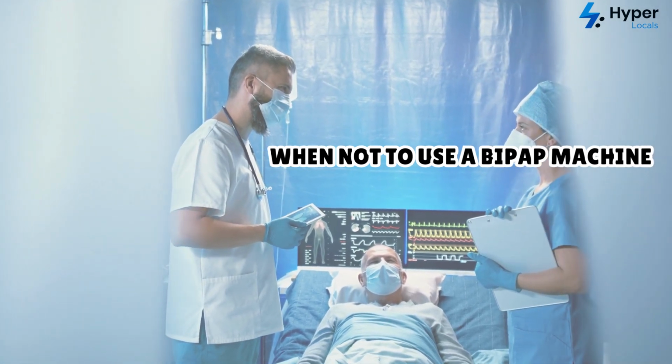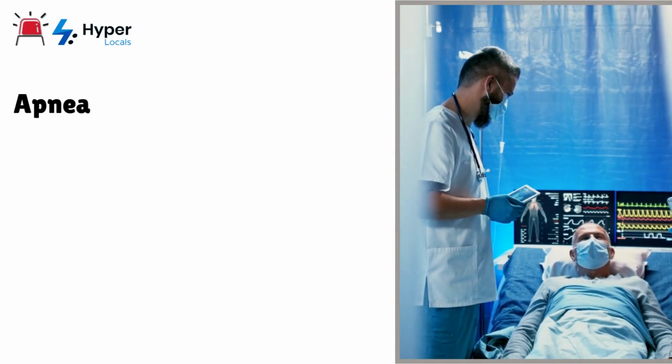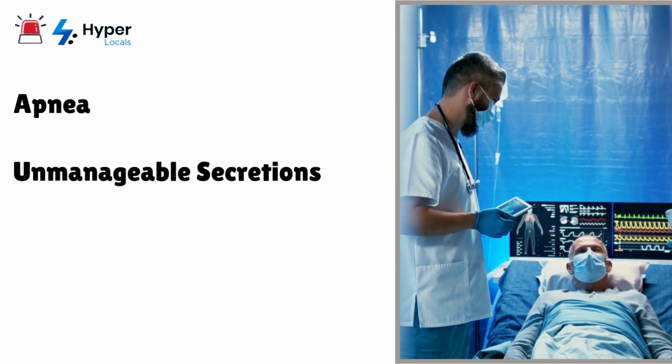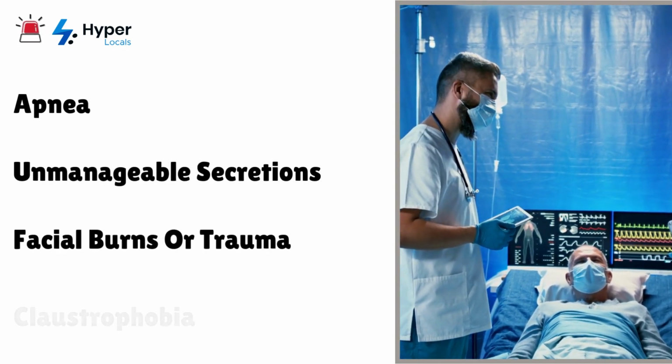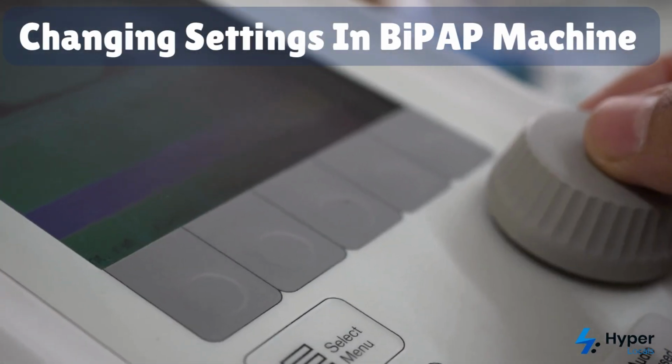Since we talked about when BiPAP would be indicated, now we need to mention when it shouldn't be used, or the contraindications for BiPAP. And they are: apnea, unmanageable secretions, facial burns or trauma, claustrophobia.